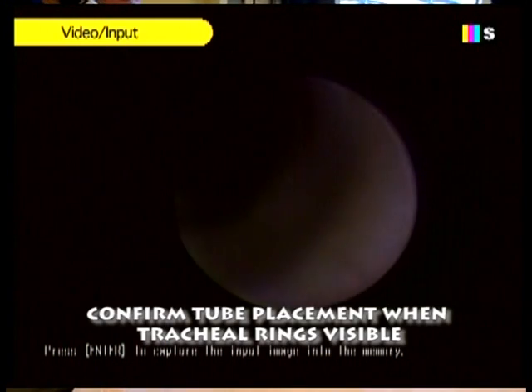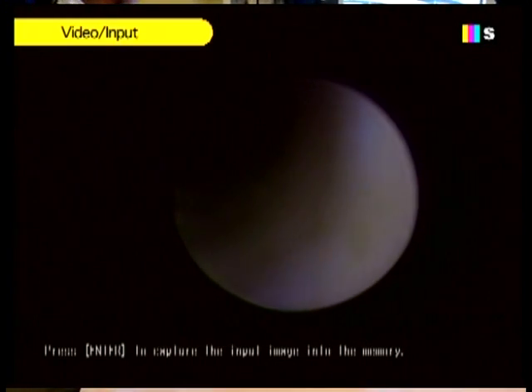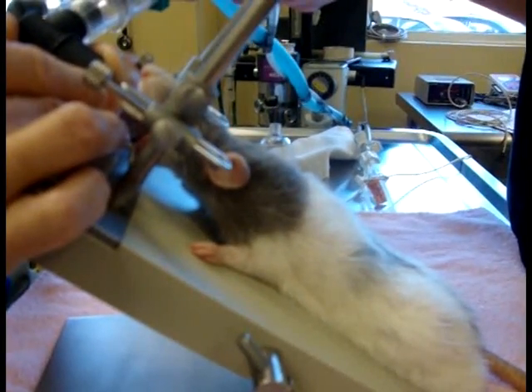We're actually in the trachea, looking at tracheal rings — we're intubated. When we press on the bag, his chest goes up and down.